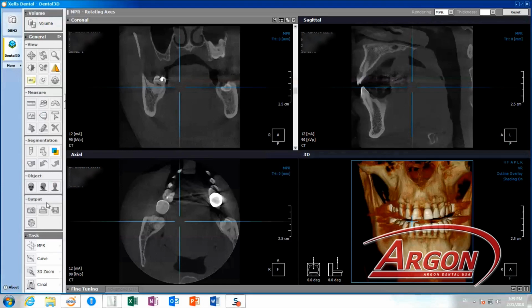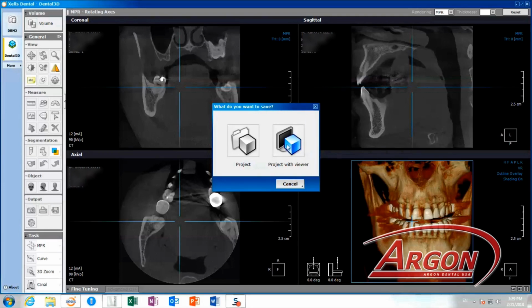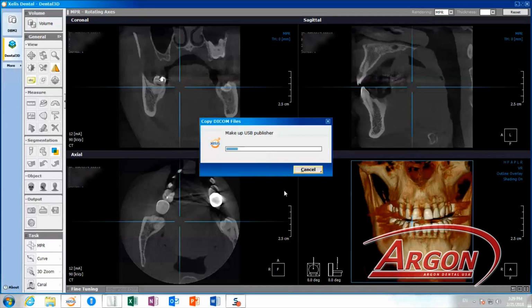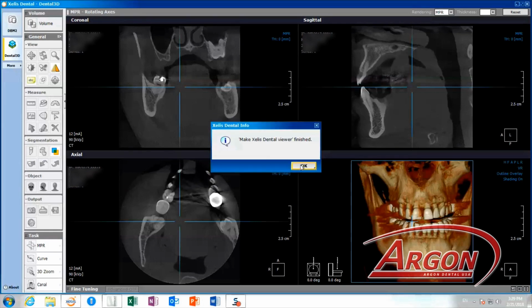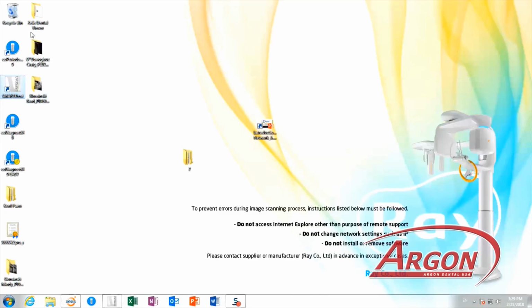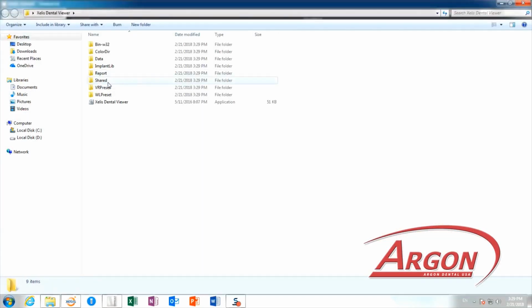And under the Output tab, you will save your project with Viewer. Again, you will select where you want that file to end up. We will again put it in our desktop. And once the export is complete, you can open the application just to make sure that your file is there.